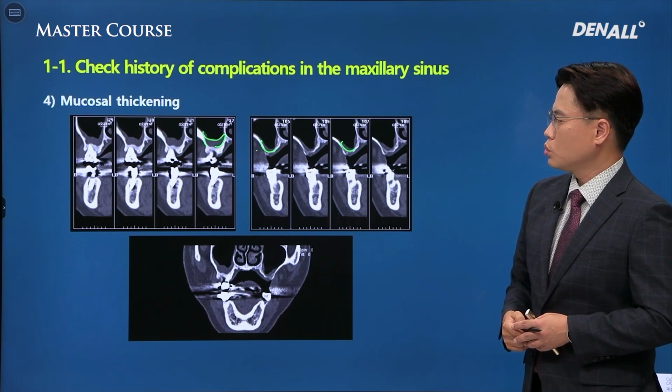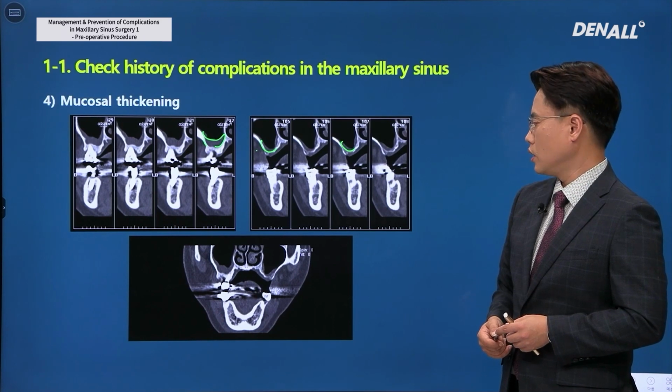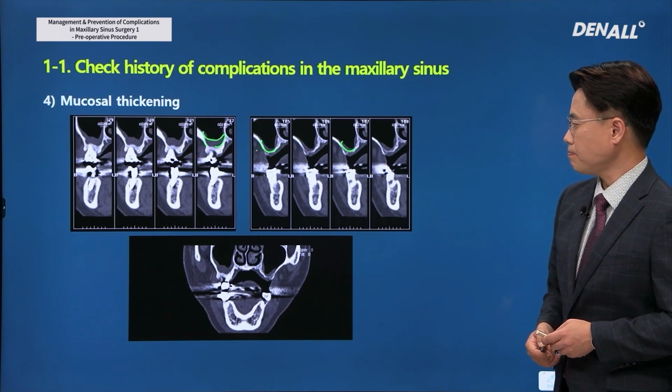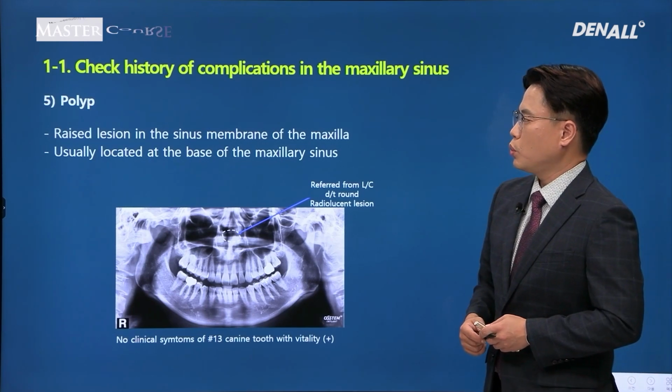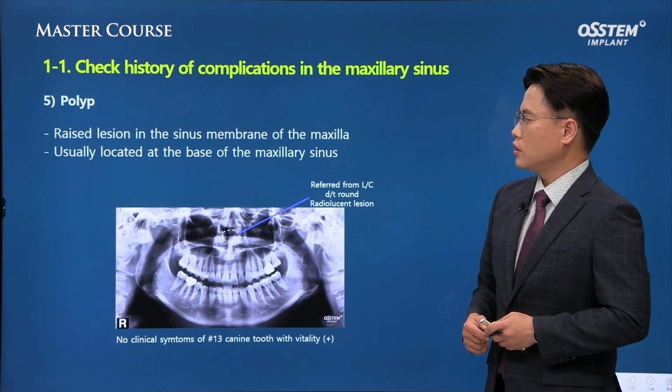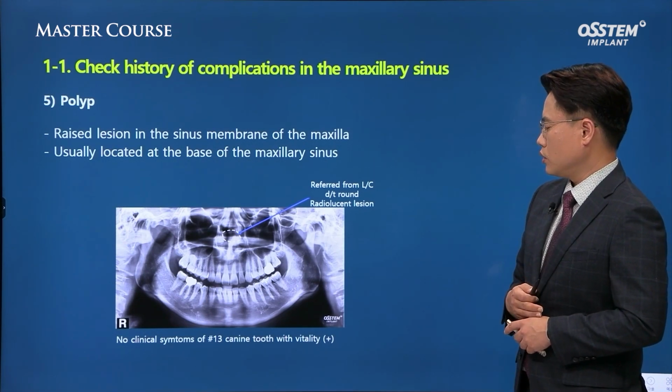Once the thickness is reduced, then you can proceed with sinus surgery in a more easy manner. Next is polyp. I have not experienced the polyp that much. This is a case from another dentist.